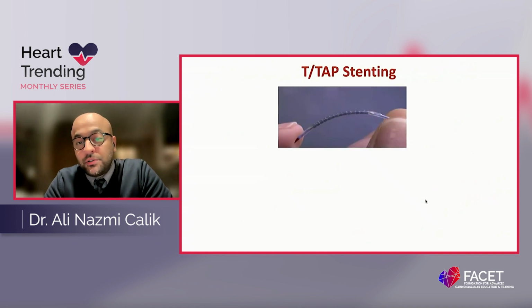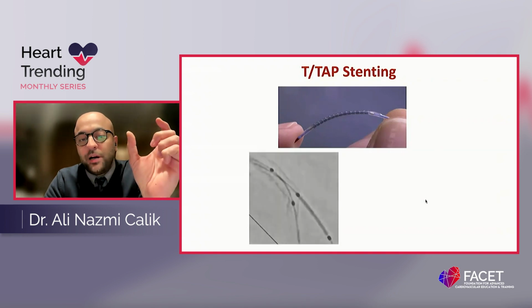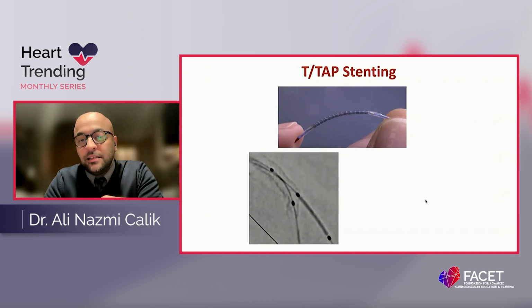And another important aspect is what I mentioned in the beginning of my presentation, the relation between the radio-opaque marker and the stent itself.